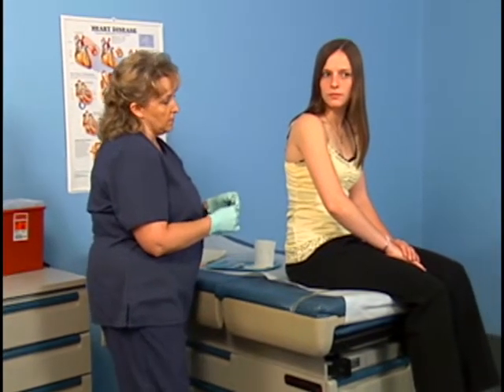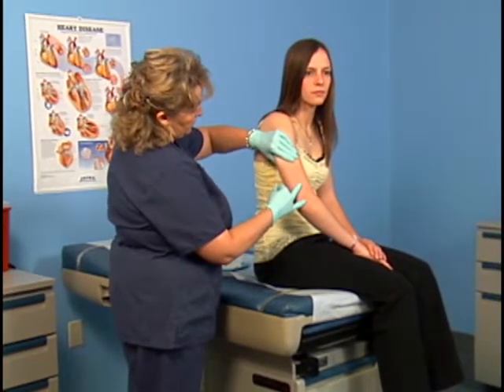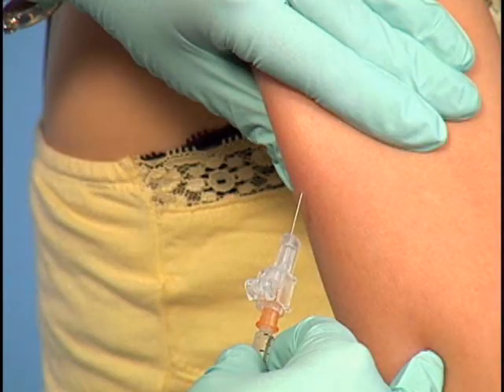Position your non-dominant hand on the area surrounding the injection site. Grasp and hold the skin in a cushion fashion for a thin patient such as Carmen. This ensures that the subcutaneous tissue and not muscle tissue is entered. The skin may be held taut when administering an injection into a normal-sized adult.